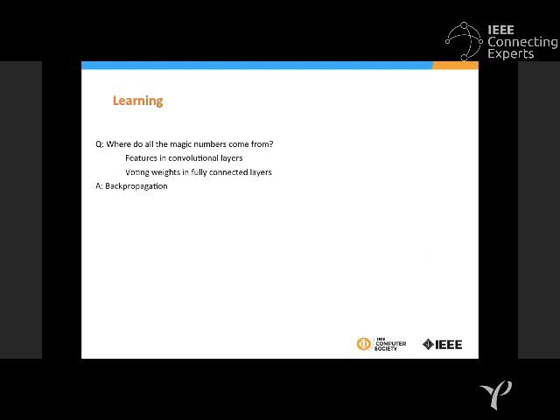And that's why deep networks are said to do feature extraction and classification in a seamless way. That means you don't have to interrupt the system, saying first I do feature extraction, first I learn the features as step one, and then I push the features to the classifier to classify well, which is the traditional machine learning. That's the way deep learning works very efficiently. But again, you have to remember that as the features are learned automatically, you have to supply your network enough information so that all possible features are well learned by the network.